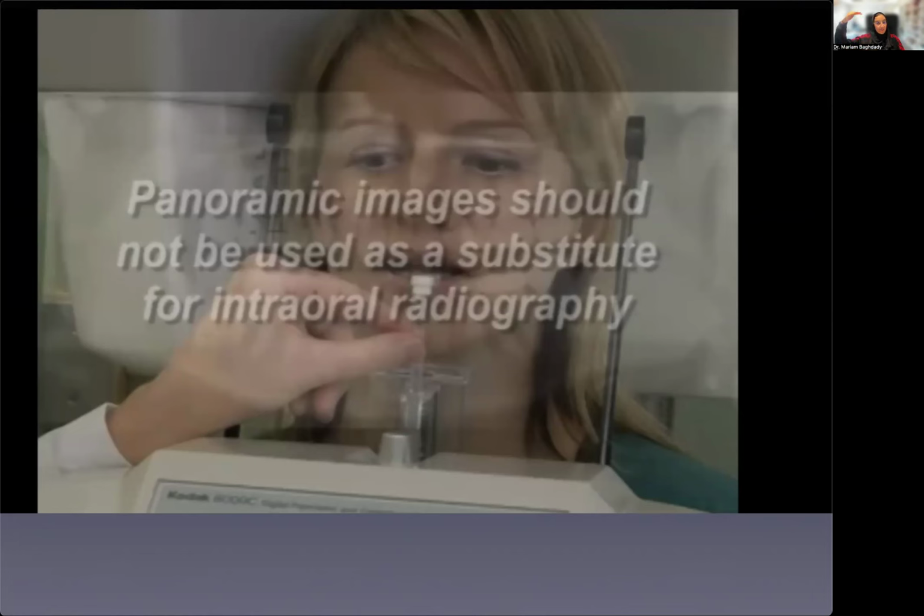We're going to set the machine to my height before I even get into the machine and start positioning. If I have a little child, then I'm going to bring down the machine all the way to the little child. If I have a patient in a wheelchair, we're going to bring it down to that patient, depending on how they are before we even start. So we're going to eyeball the patient's height and bring it to their height.